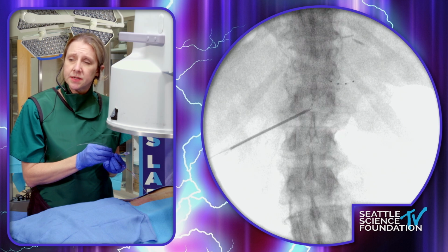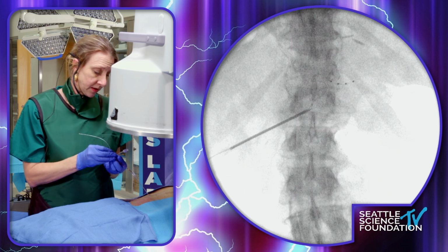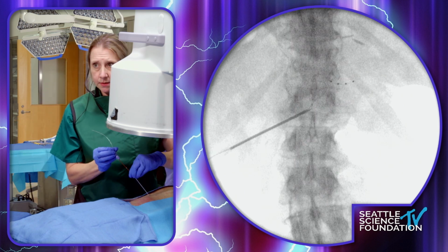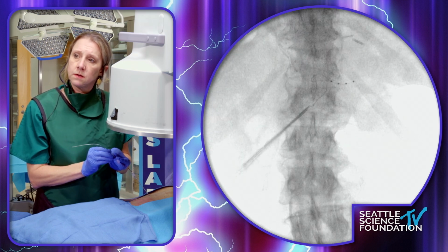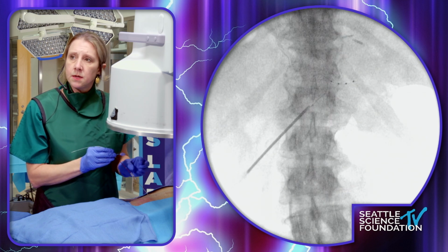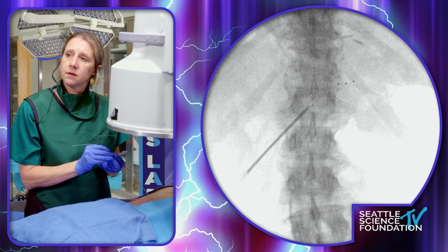Now, what I'd like to do is create a little bit of a loop that just reinforces the position of this lead within the neural foramen. So what I'll be doing is turning my whole assembly inferiorly. And live, please. Picture. Stop. And back up toward the patient's opposite shoulder. Live.